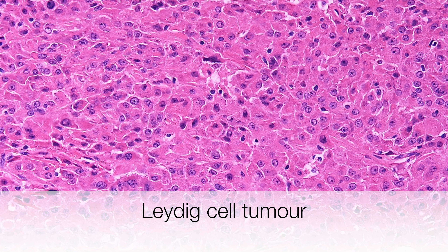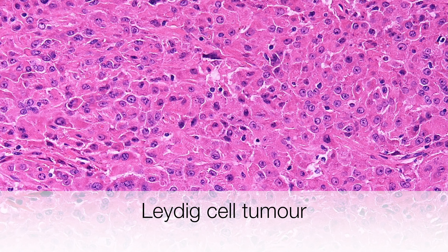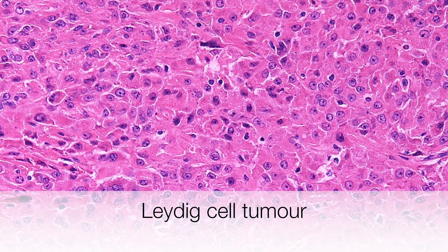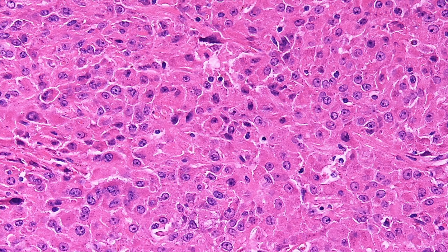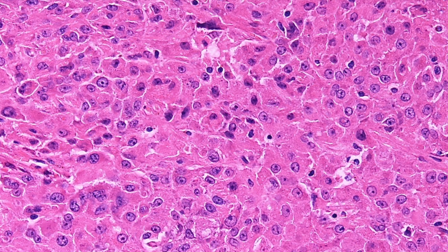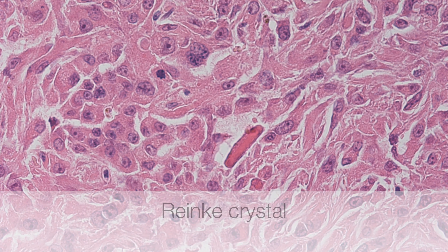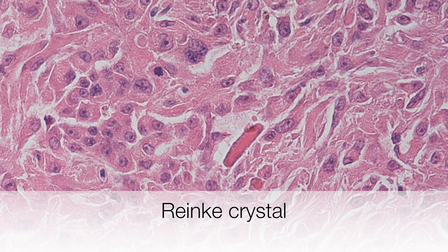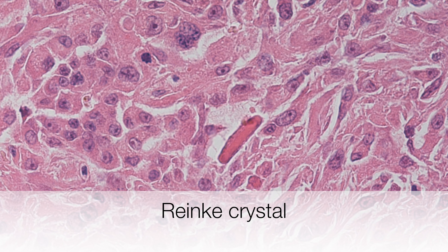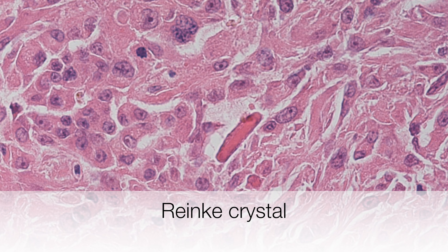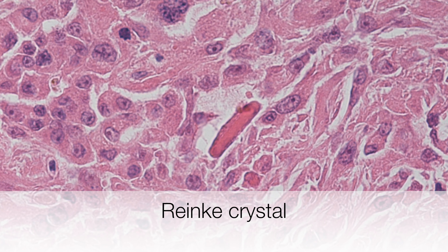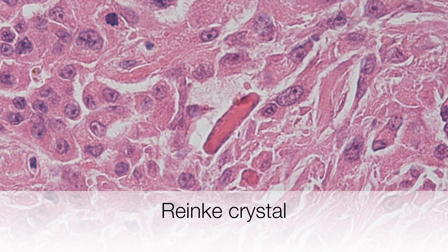This is the typical histology of a Leydig cell tumour and it is composed of sheets of cells with granular pink staining cytoplasm. The rod-shaped pink structure we are zooming into is an example of a Reinke crystal or crystalloid.